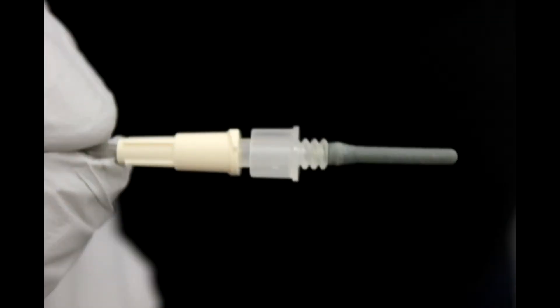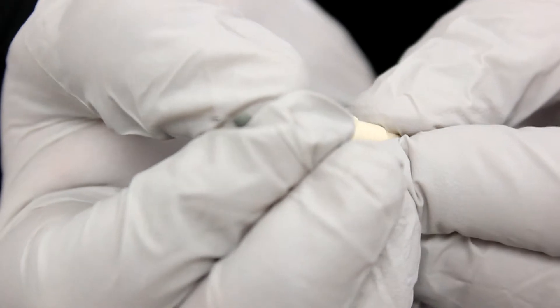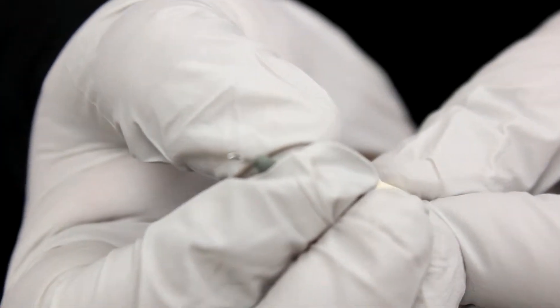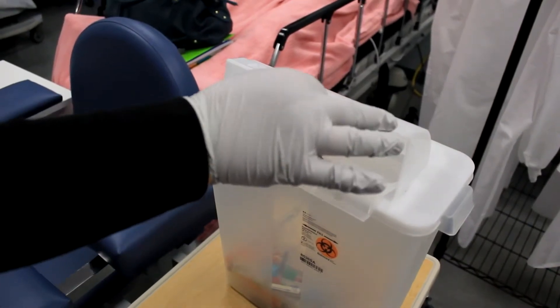Exercise caution when removing the collection set from its packaging as many sets contain a vacutainer adapter. Note that behind the rubber sheathing there's a needle. The adapter can easily be removed and disposed of in a sharps container so that the collection set can be utilized with a syringe.